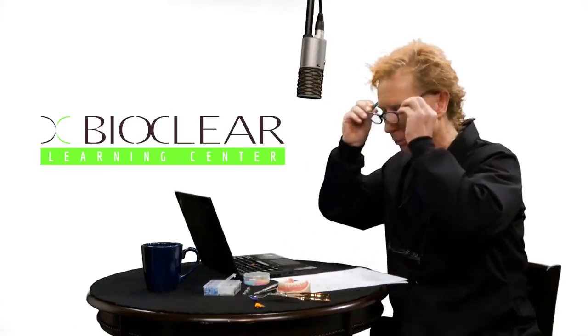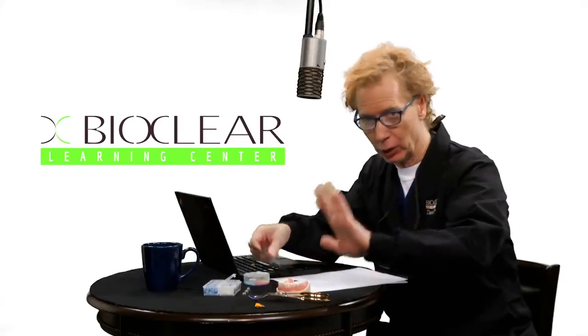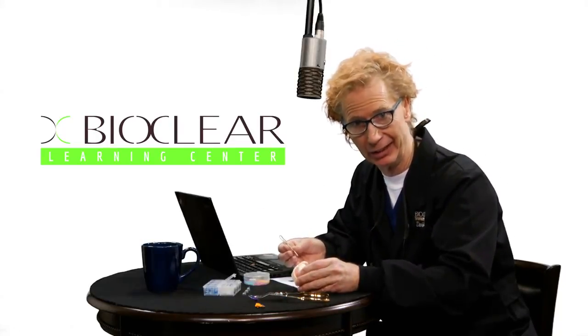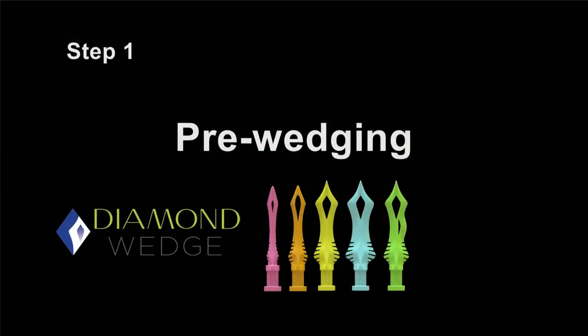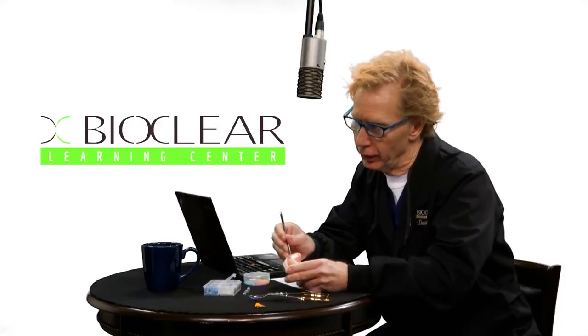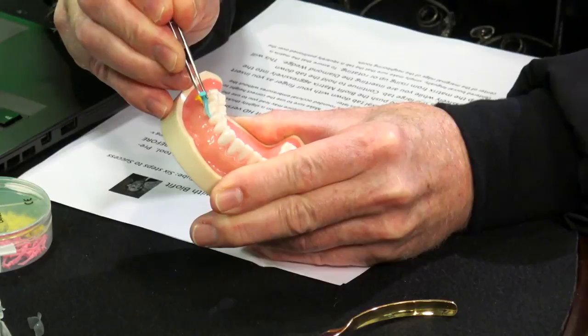Number one: pre-wedging. Pre-wedging has a whole bunch of benefits we can review another time. We want to place the pre-wedge before we cut the cavity preparation. We're going to insert the appropriate diamond wedge at about a 45-degree angle, like a suture needle.